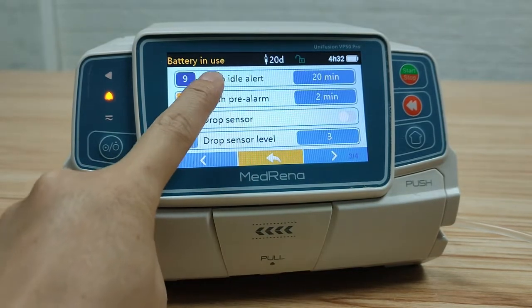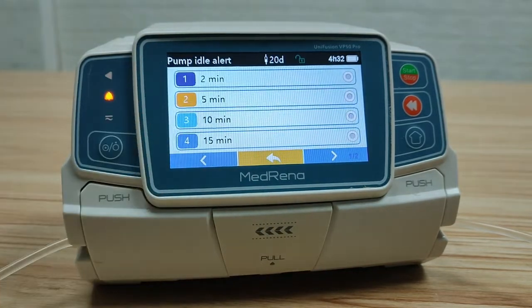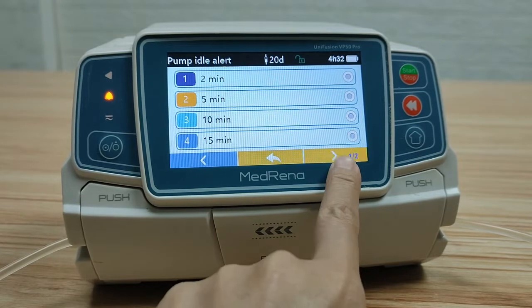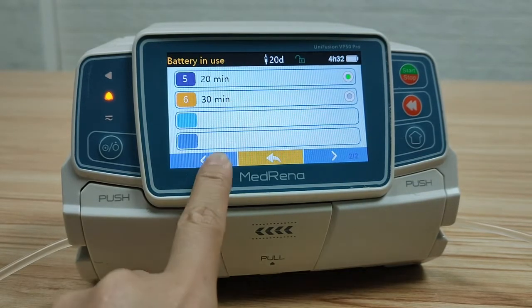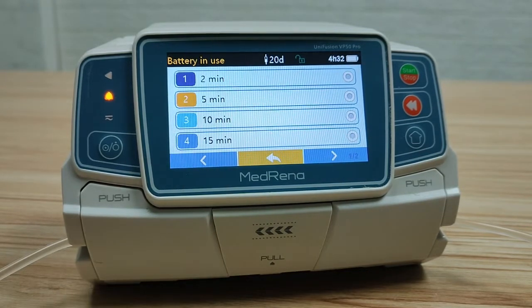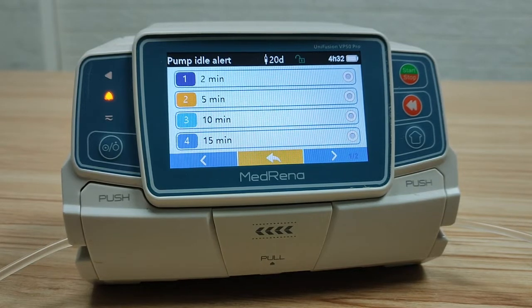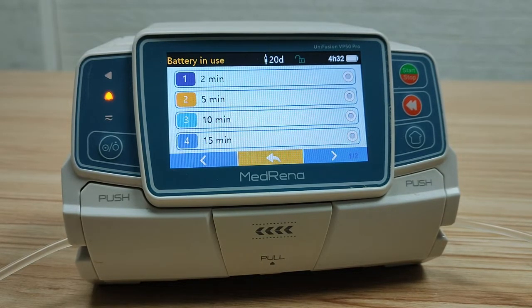Pump idle alert: there are six different time intervals for choosing. When the pump is not operated for a certain period of time, it prompts an alert to remind the user.